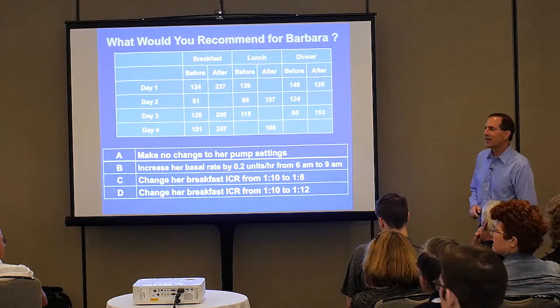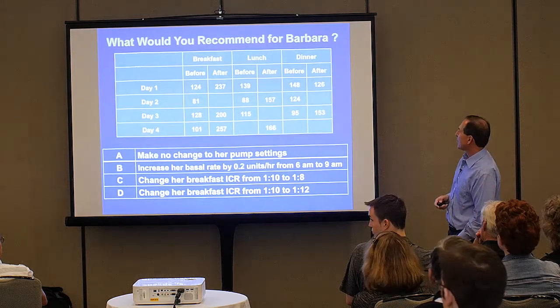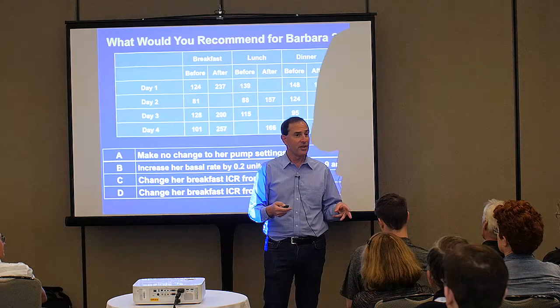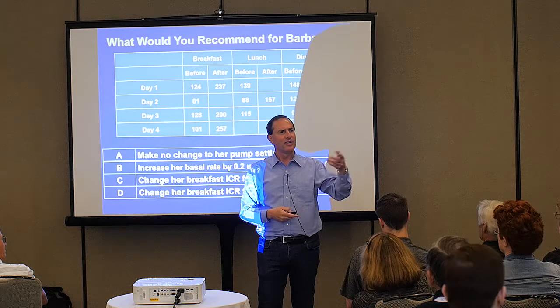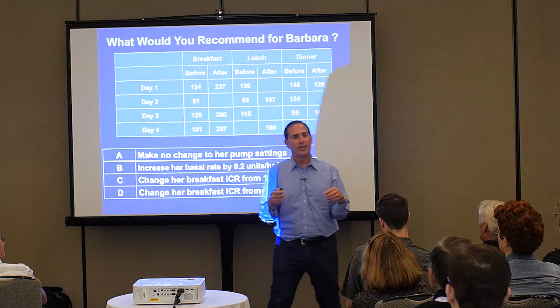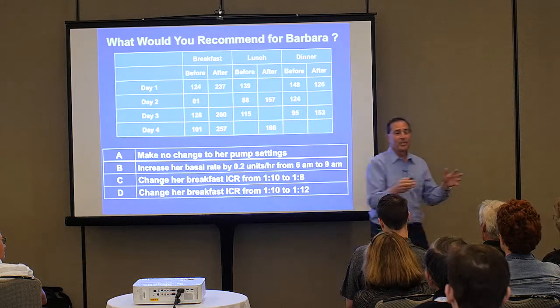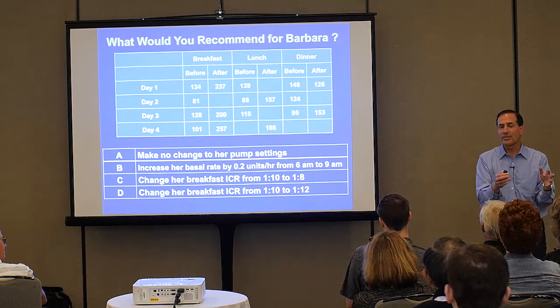Okay. There could be lots of other choices. I just have to narrow it down for argument's sake. So one key thing about bolusing before meals: how long, if at all, before your meal do you bolus? 5 minutes, immediately after, depends on what you're eating. Right. So there's this ideal theoretical world, and then there's real life.